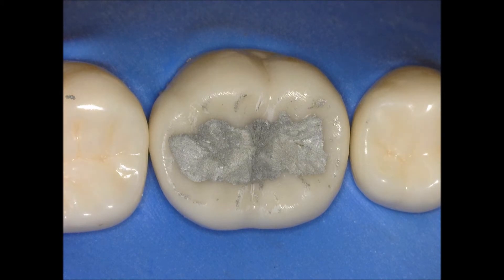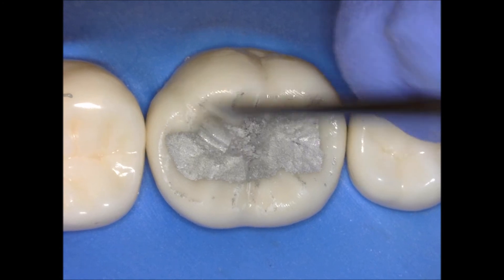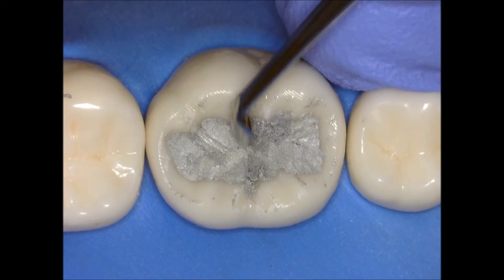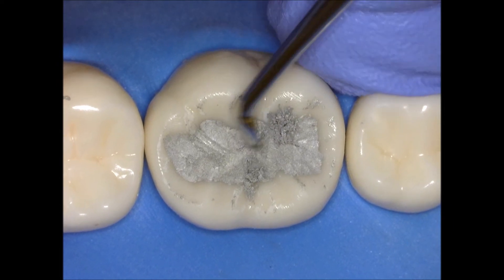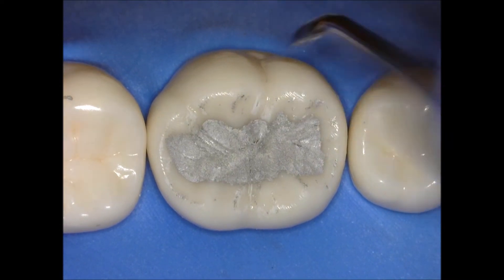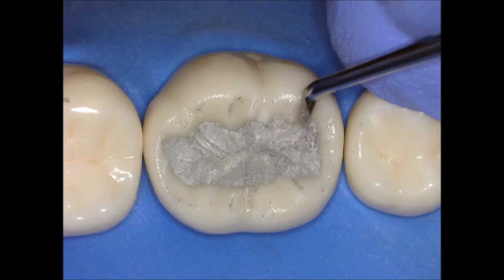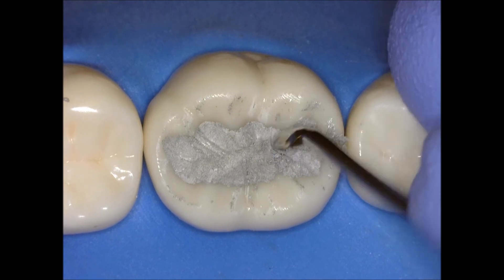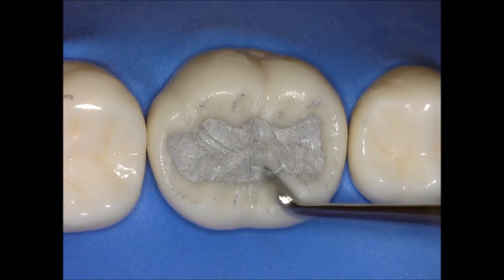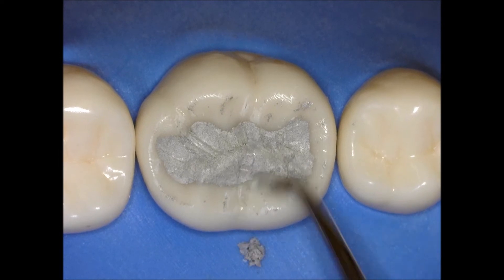I'm using my cleoidiscoid to start creating the anatomy. I lay my instrument against the triangular ridges and am just removing and carving that amalgam. Make sure you're not scratching and trying to carve the central grooves directly — by carving the triangular ridges it will give you the anatomy. It's the same principle as waxing dental anatomy. I'm moving my instrument in the same direction of the triangular ridges, trying to do cusp by cusp — I think it's easier to do one cusp at a time.